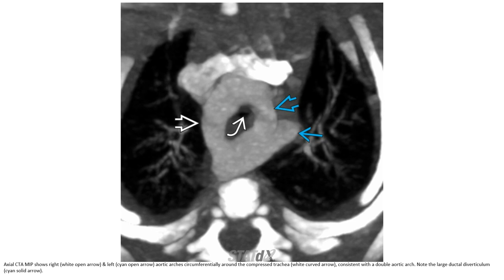Axial CTA MIP shows the right and left aortic arches circumferentially surrounding the compressed trachea, consistent with a double aortic arch. Note the large ductal diverticulum.